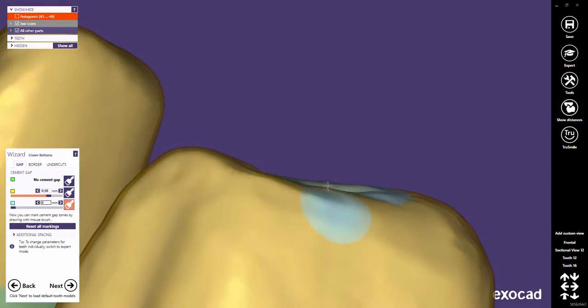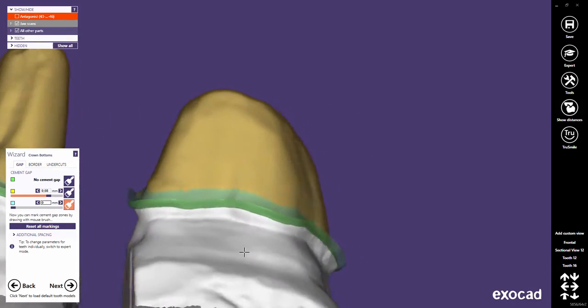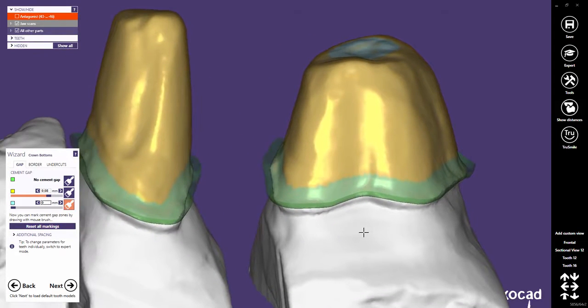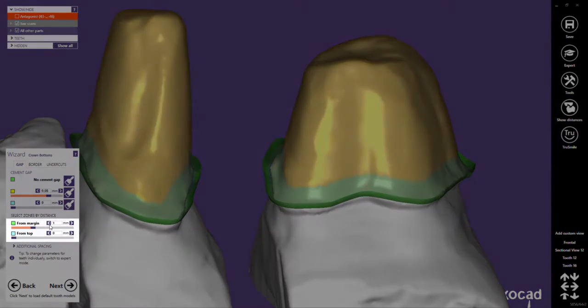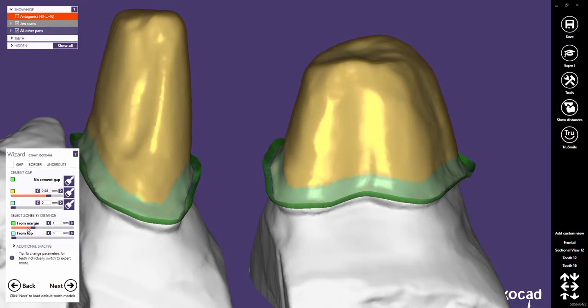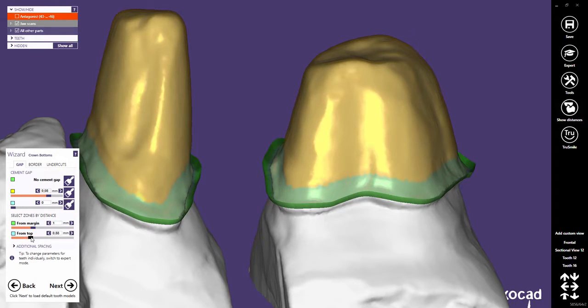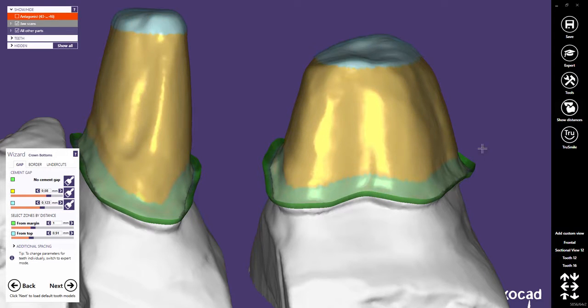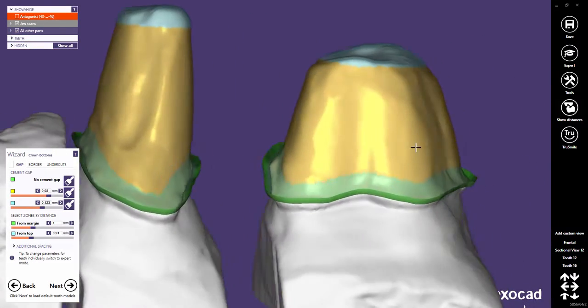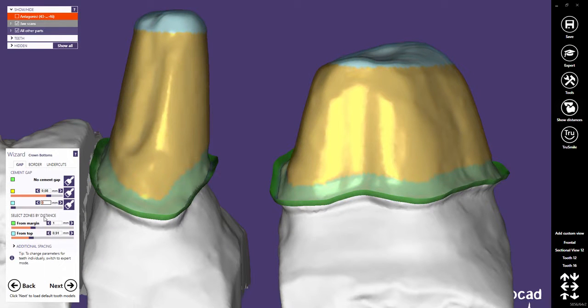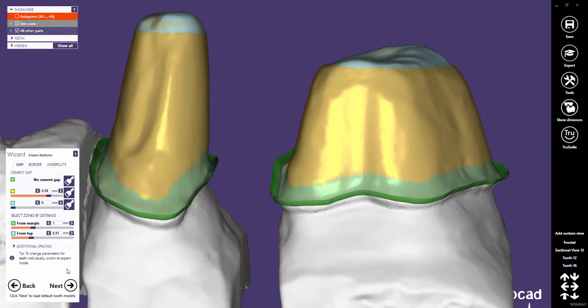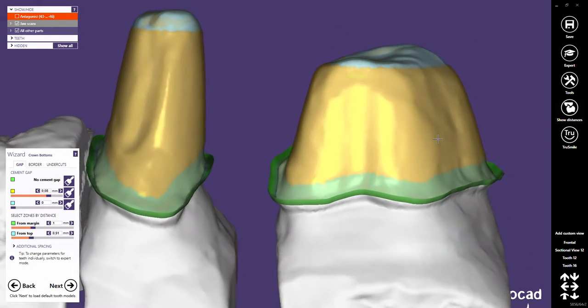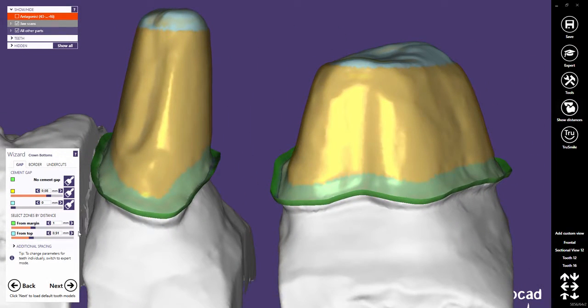Maybe you already noticed that if you reset all markings, the distance sliders for each zone become active again. Now you can even define a distance for the blue area from the top. You can again adjust the cement gap thickness in this zone. The blue cement gap zone will disappear if you choose zero as a distance.